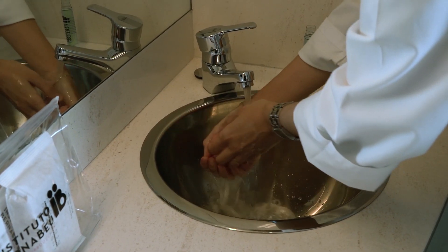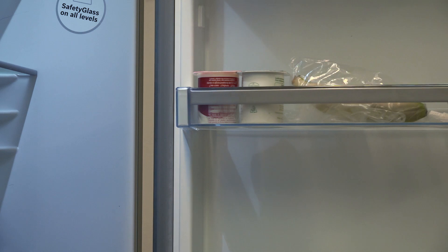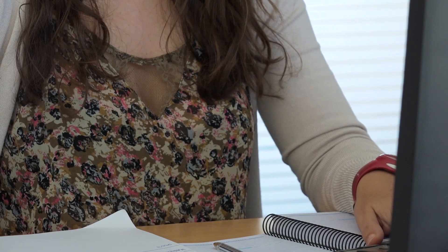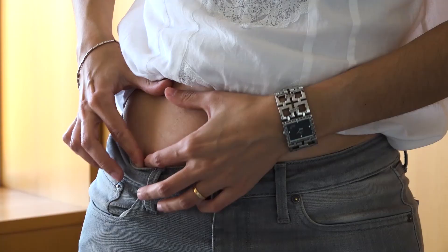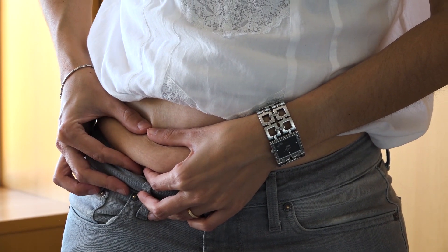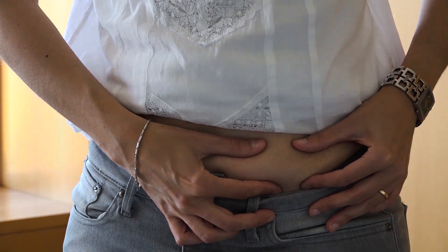Before starting, wash your hands. If you store the medicine in the fridge, we recommend removing it five minutes before you begin so that it can get up to room temperature. Ensure that you take the medication at approximately the same time every day. The next time you take the medication, ensure that you administer it in a different area in order to improve absorption and reduce pain.